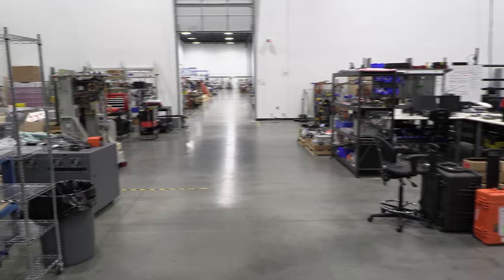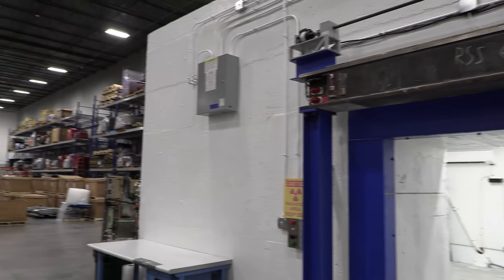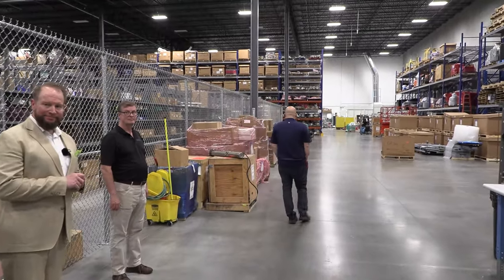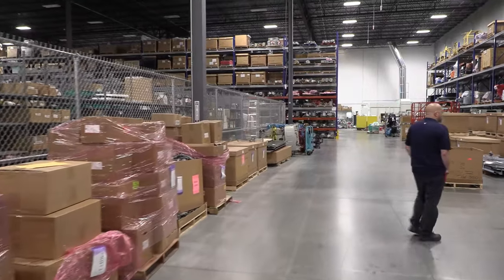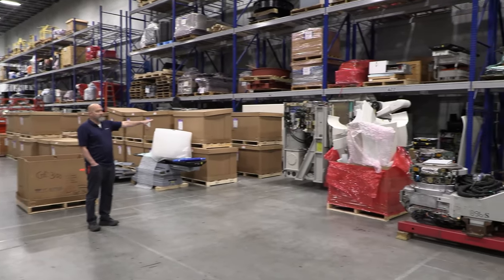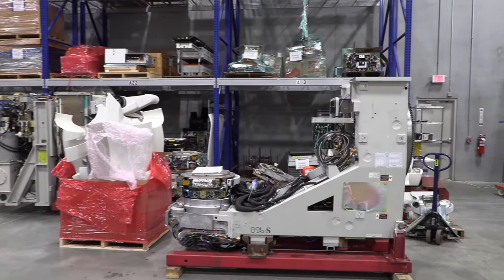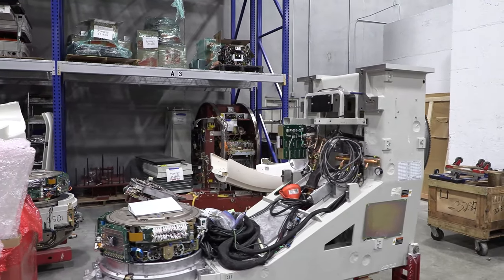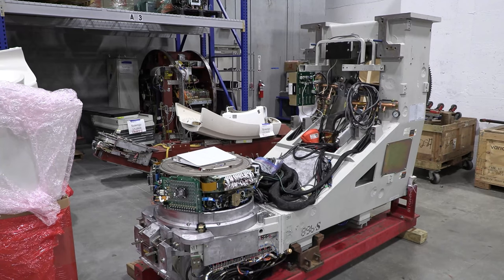Don't worry, guys. We'll cover all those areas just as well. What a crazy, crazy system. I'll show you the machines. Okay. There we go. Cramped up. I'm so thankful for this tripod. Well, this is just the gantry. This is a gantry and a stand still connected. So we try to remove it in one piece, a lot easier. And I think there's like 30 bolts or something like that connected with the gantry bearing there. So it's a lot easier. A lot of people have never seen linear accelerators with the doors and all the covers off.